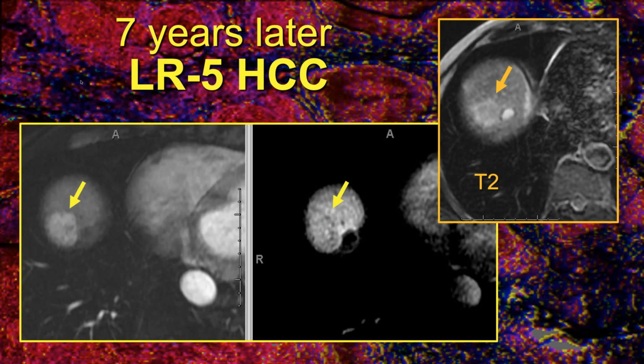It's hyperenhancing with washout. There's probably a little bit of arterial portal, or a little bit of perilesional delayed enhancement. Notice on the T2 weighted image to the right, you can see it's right next to that cyst, so we're definitely looking at the same thing. Moderately intense on the T2 weighted image. Doesn't have threshold growth because it's been 7 years, so we don't know if it grew fast enough, but we're still sure it's hepatocellular cancer. Goes to multidisciplinary management, and that's where the decisions get made.